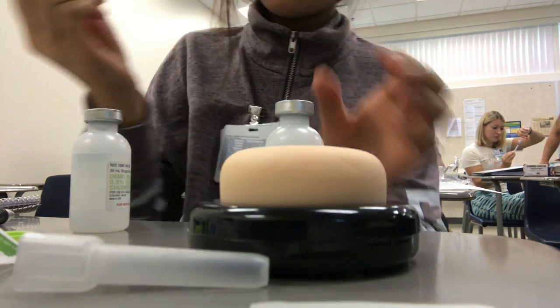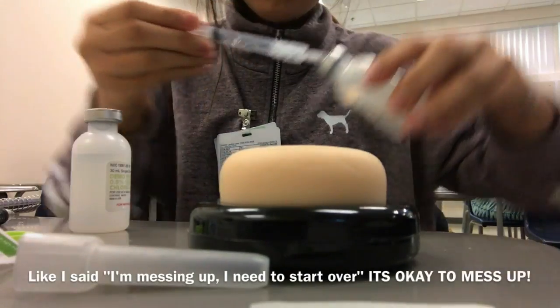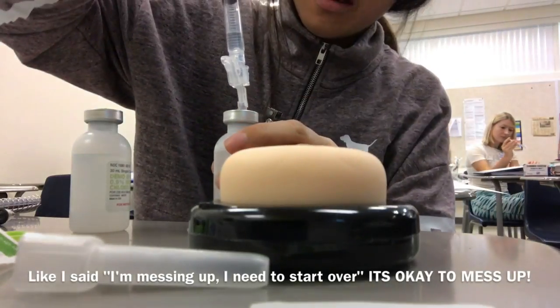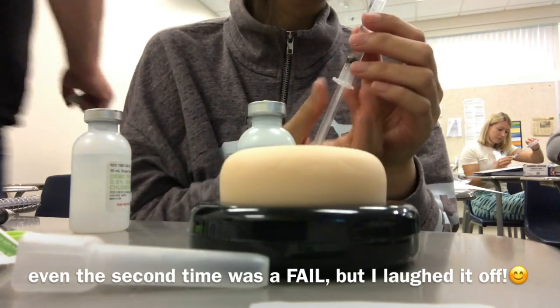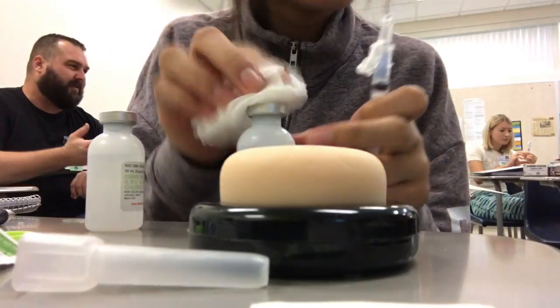One. And then... Oh, my gosh. That came in so fast. Okay, I'm messing up. I need to start over. I messed up. Let's do that one more time. I'm watching her doing that.